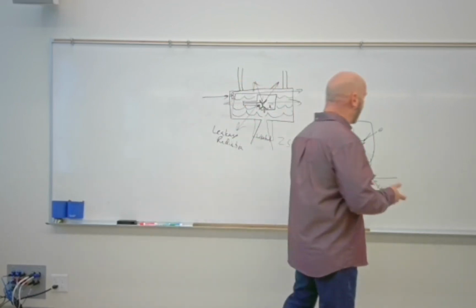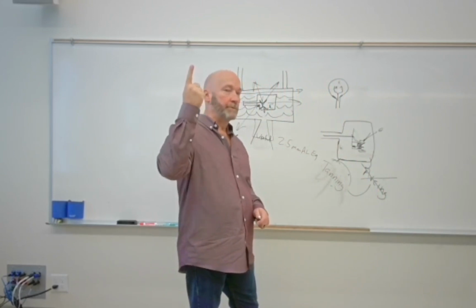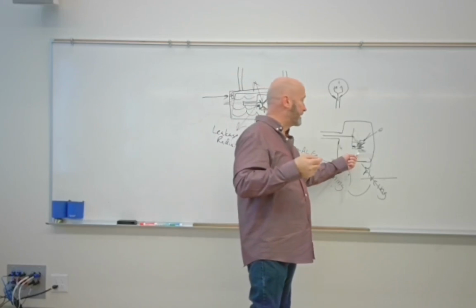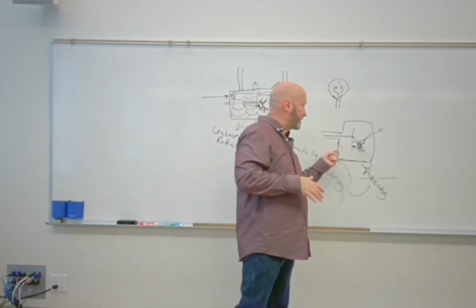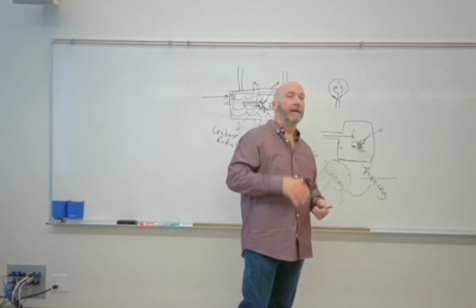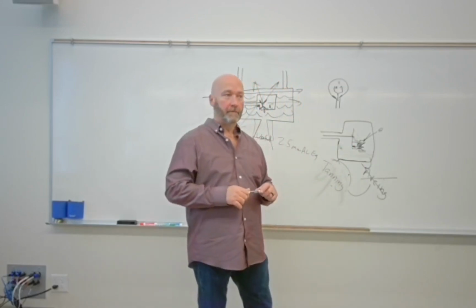Okay, so in the cathode, we've got two filaments, big one for big exposures, little one for sharpness, recorded detail, both inside of the focusing cup. Purpose for the focusing cup: compress the stream of electrons so they impact a smaller area on the face of the target, increase the sharpness, recorded detail. Okay.